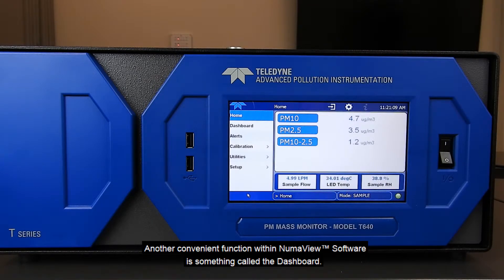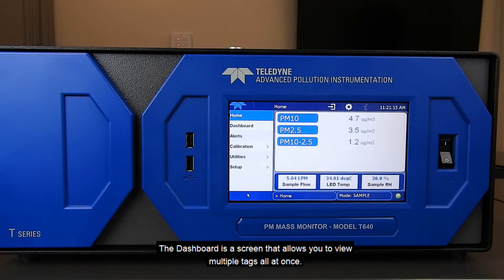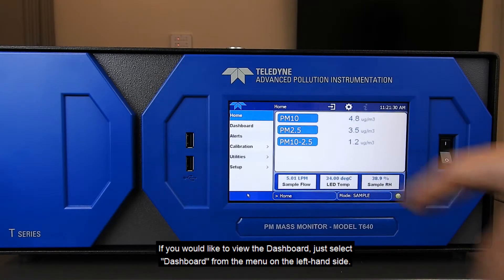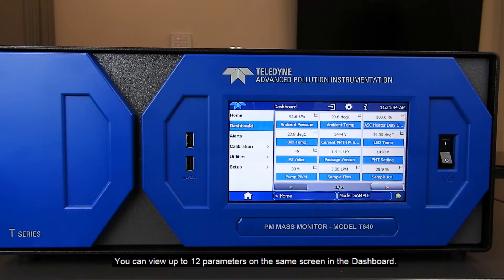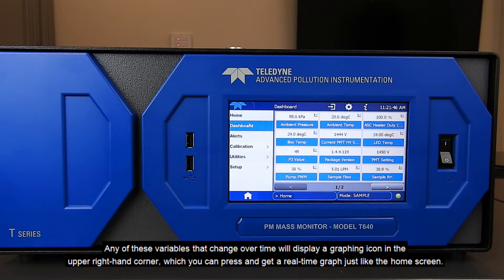Another convenient function within Numaview is something called the dashboard. The dashboard is a screen that allows you to view multiple tags all at once. Just select dashboard from the menu on the left-hand side. You can view up to 12 parameters on the screen. Any of these variables that change over time will display a graphing icon in the upper right-hand corner, which you can press to get a real-time graph just like the home screen.